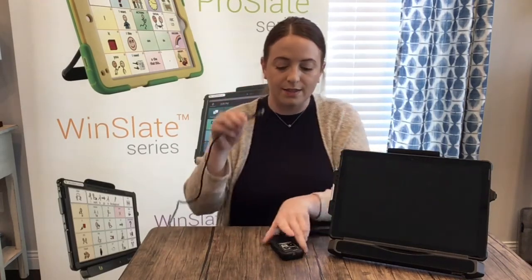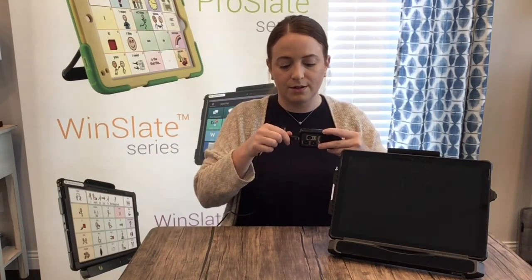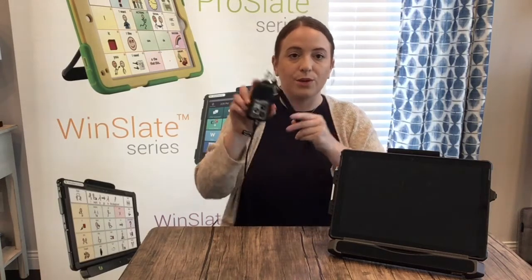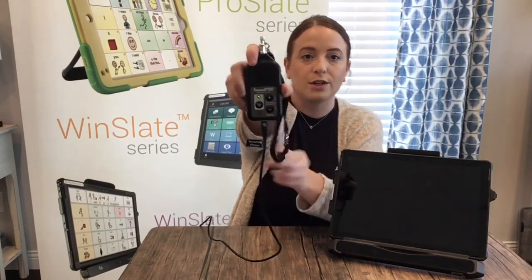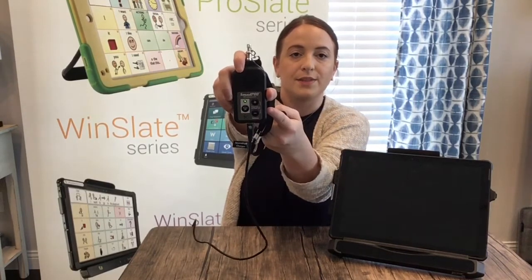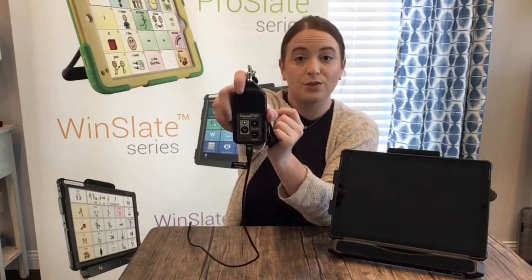Find the sound pod charger and look for the dot on the top. This matches with the top of the sound pod. Plug those in together and that's how we know it's charging. You'll see the flashing orange light — the dot and the top of the sound pod go together, and the orange light tells us the sound pod is charging.